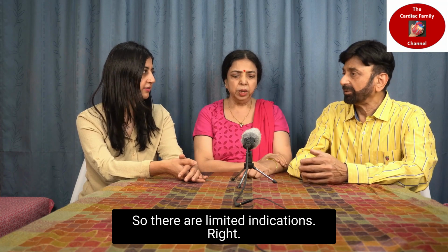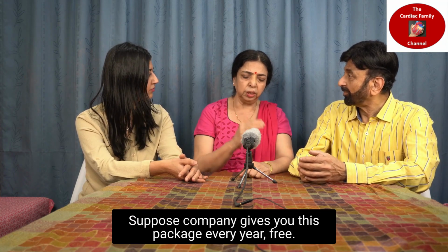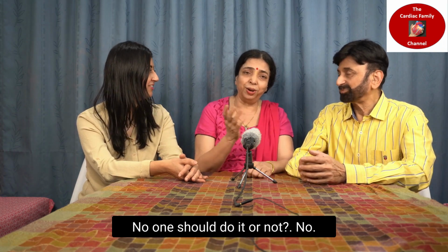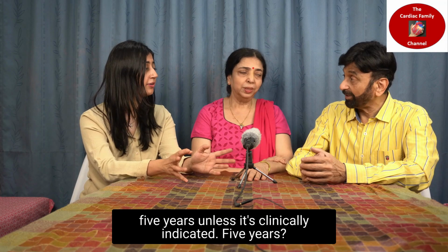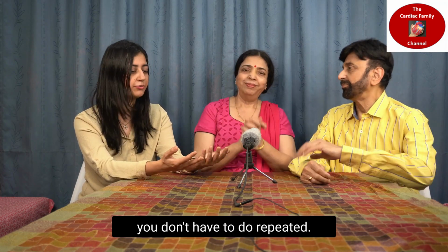Suppose a company gives you this package every year free. Should you do it or not? No. If you do a CT coronary angiogram once, don't do it for at least the next 5 years unless it's clinically indicated. You don't have to do it repeatedly, otherwise you will be subjected to radiation.